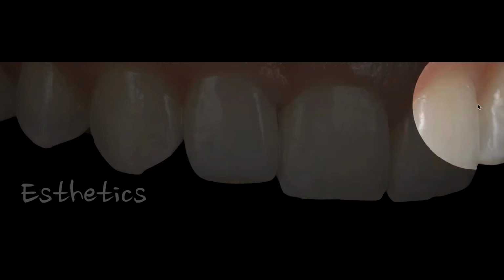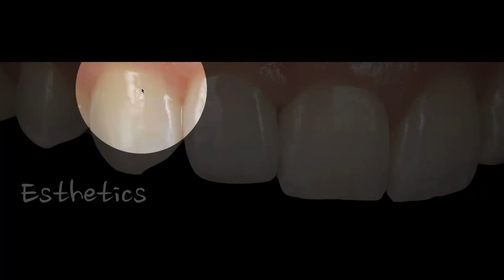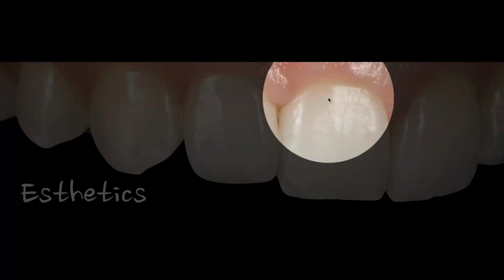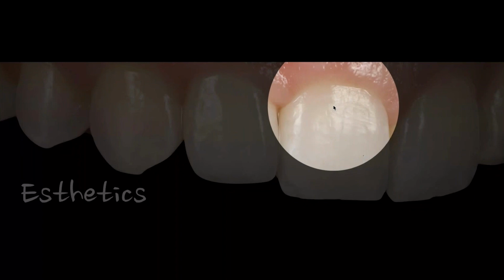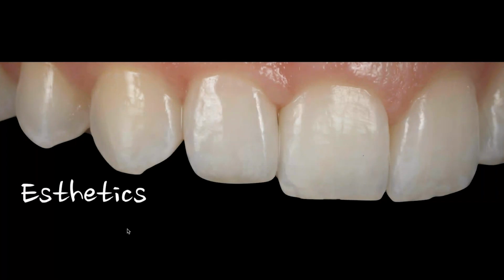I don't really show you this one, but let's look at the surface here on the central, and let's look at the surface on this cuspid. What you should notice is I'm kind of in the middle. I don't know if I have as much surface as I see here on this central, and maybe I have a little bit too much compared to the lateral, right? So I'm kind of in the middle of the two of them. And actually, I'd say that's acceptable. Where it's not acceptable to me, and again, light reflection, notice the line angle on the cuspid, line angle on my lateral.